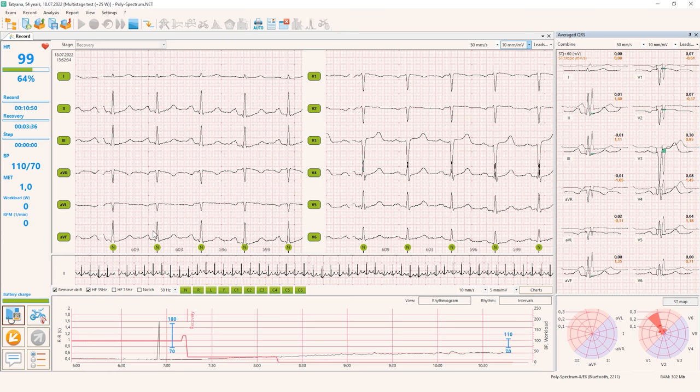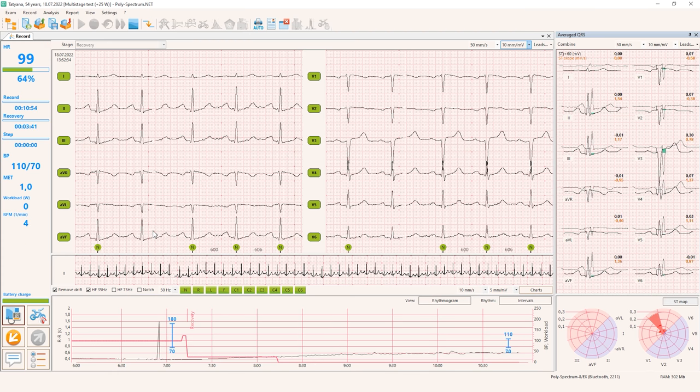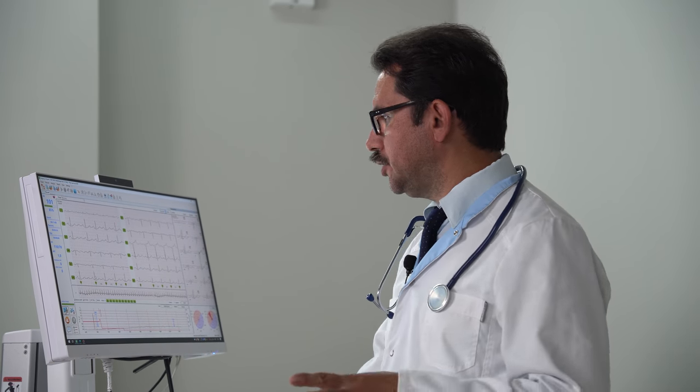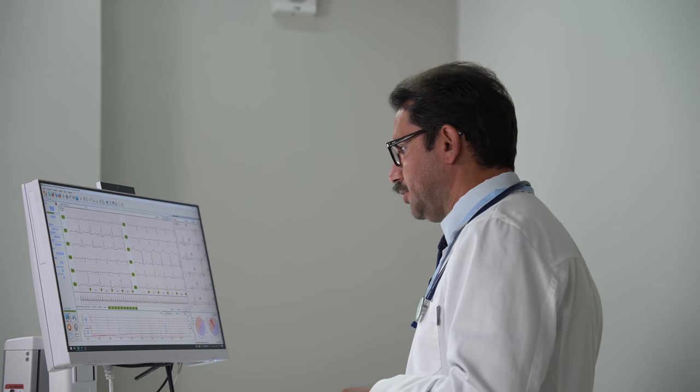You cannot think about waiting for heart rate recovery because it can take a long time, especially if the test was with a high workload, with high heart rate. Like in our case, we achieved almost 100% of age predicted heart rate. So we don't need to wait till the heart rate will be the same as before the test. But what we must wait? You must wait for elimination of any symptoms, elimination of any exercise-induced ECG changes like ST segment depression or elevation or T wave change or arrhythmia. So everything must be gone. And blood pressure, okay, blood pressure may be higher than before the test, but better we wait until it stabilizes on some level, better the same as in the beginning.